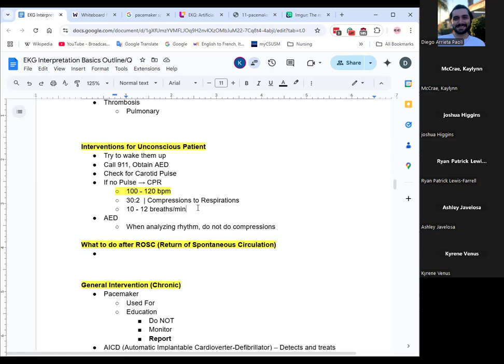Actually, you guys haven't done vents yet, have you? One of the lectures might have talked about intubation. Oh no, just kidding, no intubation. But the headboard of the bed can actually detach. You can just pull it out and technically use that as a backboard, a solid surface.